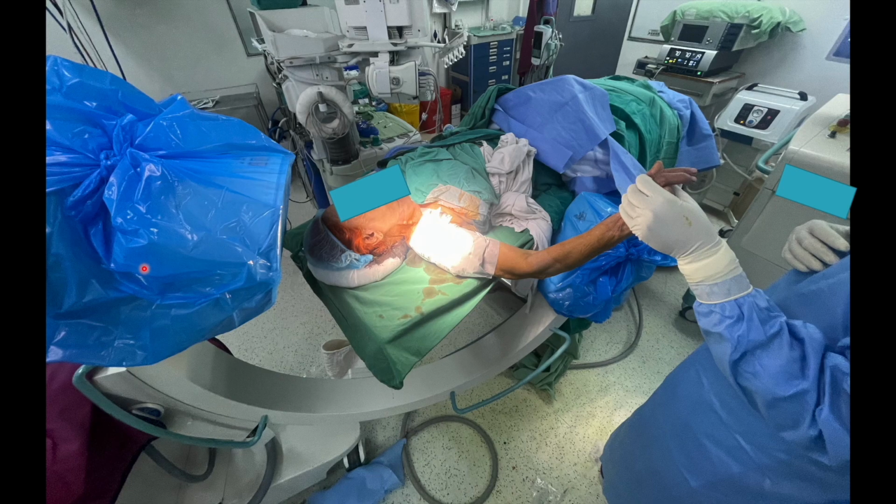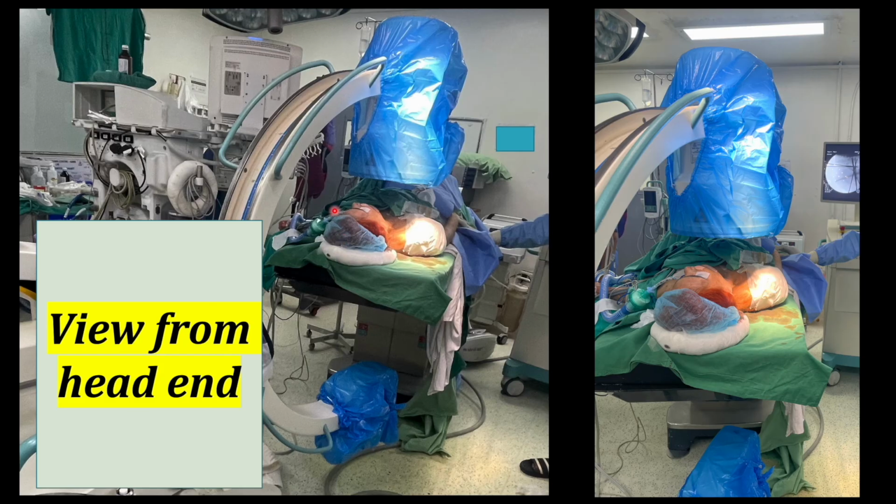So in real life the assembly should be like this. You see the whole of the operating part of the C-arm is lying on the head end, and the C-arm beam is passing slightly above the head, and it is passing through the shoulder whenever we are getting the lateral view. So the head part is not obscuring the view, and when you see from the head end there will not be any problem in the AP view, and the whole of the anesthetist assembly is lying on the opposite side of the operating table. So you are getting good space for the C-arm as well as for the anesthesia assembly and for your operating area also.